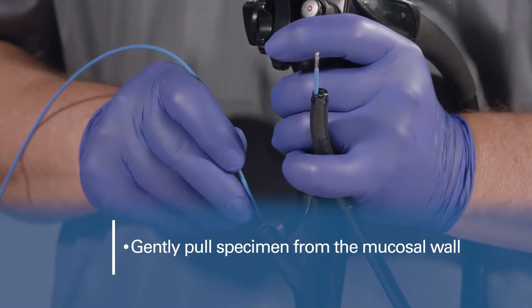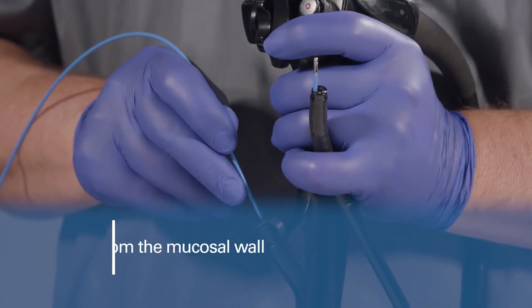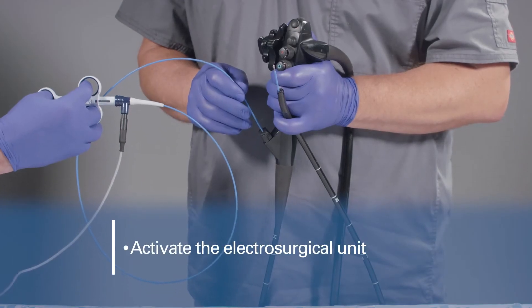Isolate the tissue by gently pulling away from the mucosal wall. Then activate the electrosurgical unit.